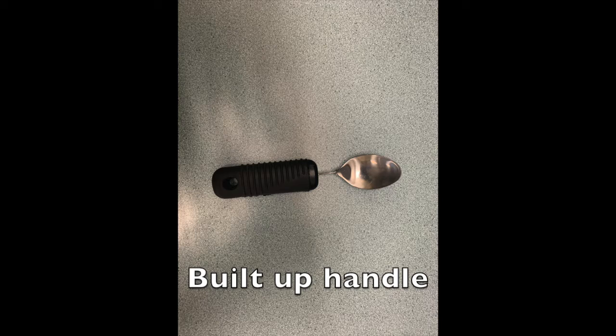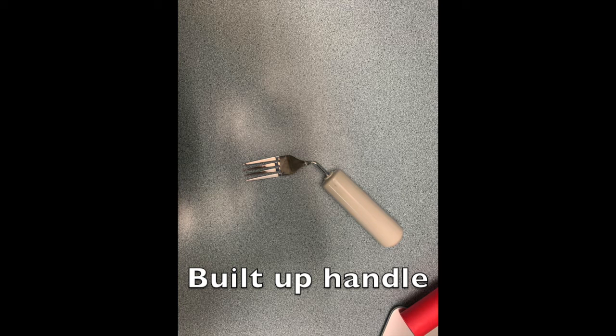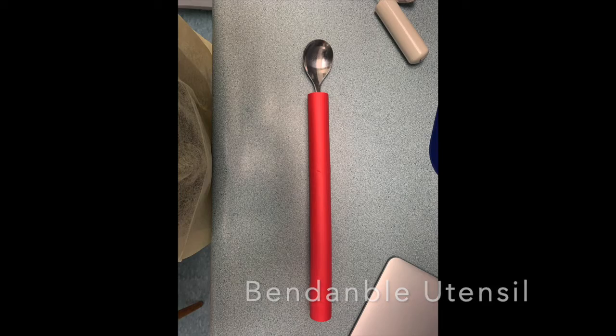A built-up handle is a fat handle for those with a weak grip. The shaft may be straight or bendable if range of motion is a concern. On a bendable utensil, the shaft can be bent to the right or to the left, which eases self-feeding for those with limited ranges of motion, or it can protect someone feeding an individual from being bent.